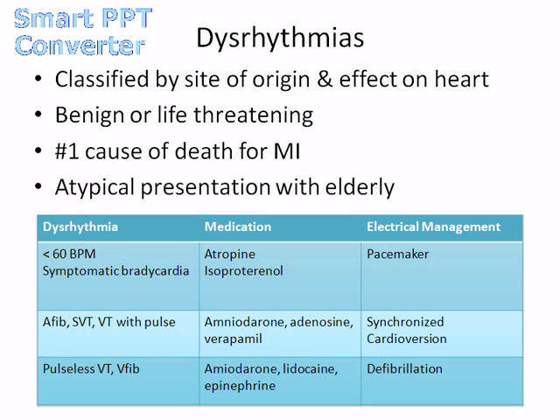Okay, when we're recording dysrhythmias, we do it with an EKG 12 lead, or with a telemetry unit or a Holter unit. Those are all connected to a machine or a monitoring system by electrodes, and those electrodes must make contact with the skin.